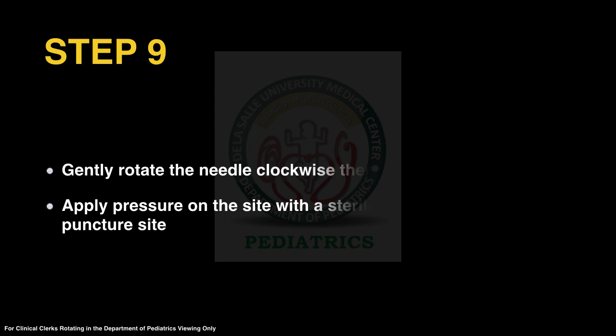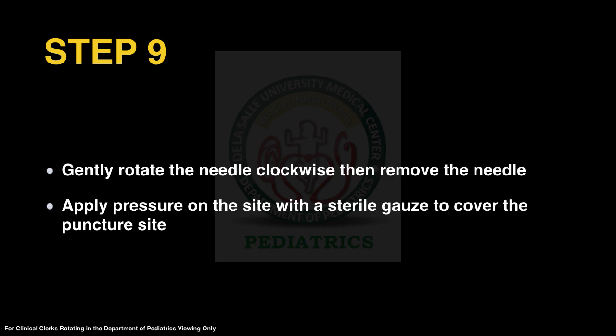After this, we gently rotate the needle clockwise, then remove the needle, and apply pressure on the site, with sterile gauze to cover the puncture site.